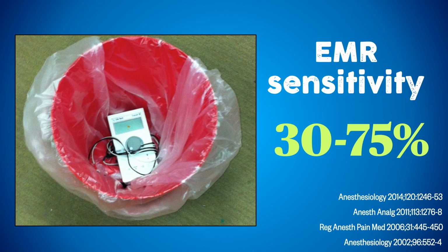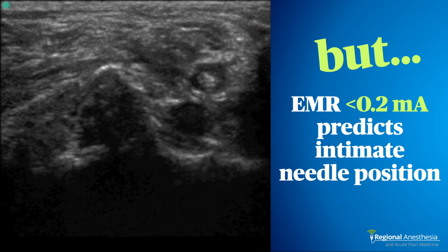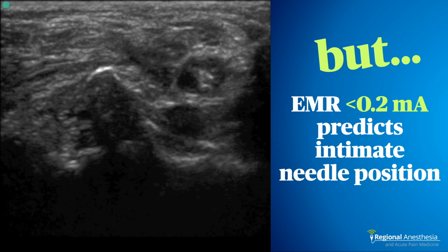Right, so in terms of detecting needle-nerve contact, yes, I will admit it's not perfect. The sensitivity of nerve stimulation is not 100%. You can be, in other words, inside the nerve, have the current on, and maybe not get an evoked motor response. But here's the thing, if you are getting an evoked motor response at 0.2 milliamps or less, you're in the nerve. Every single bit of human and animal data that we have suggests that this relationship is robust.